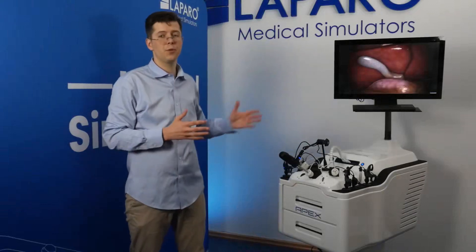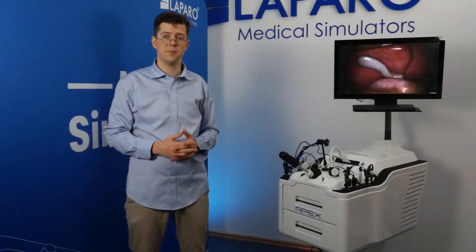Hi, my name is Zach, and today I would like to give you a very brief presentation of the APEX, the newest simulator made by LAPARO Medical Simulators.